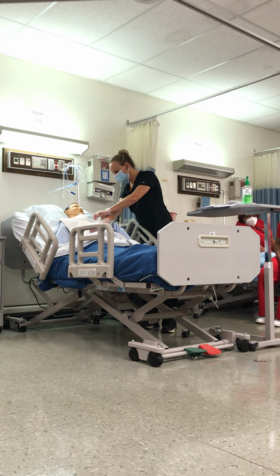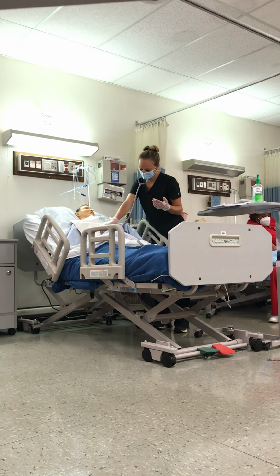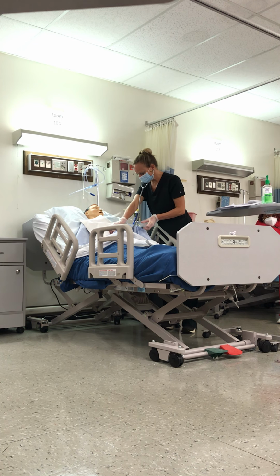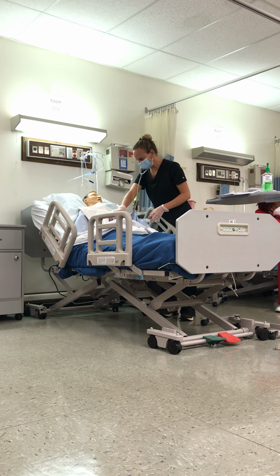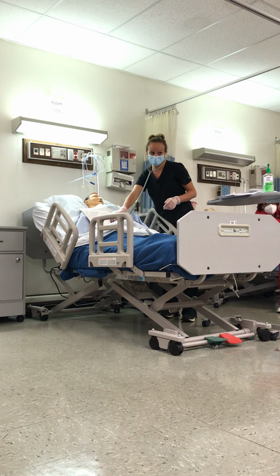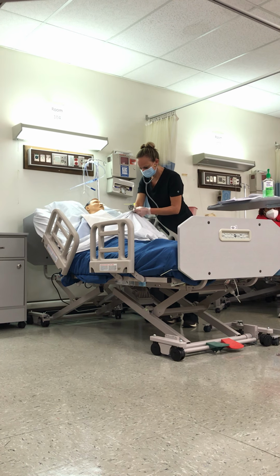We don't want to put a whole bunch. All right? I hear a bubble. This is how we do this on checkoff. Okay, I hear the air passing in. And then I would want to retract for stomach contents. And then you retract, and then all of a sudden you see it coming, okay? So you know that you're there, okay? So what do you do with those contents? It's in that tube.